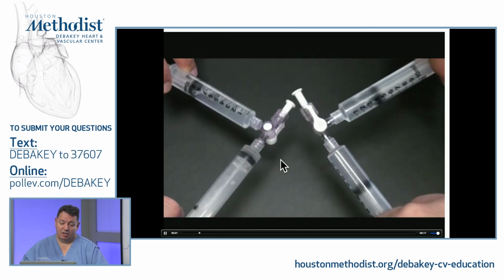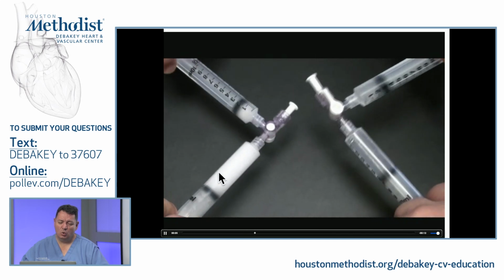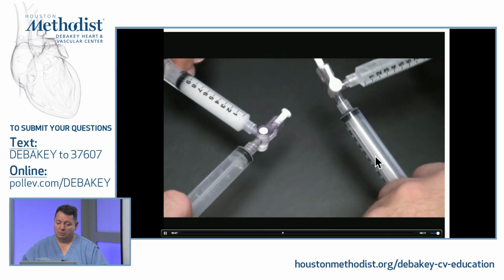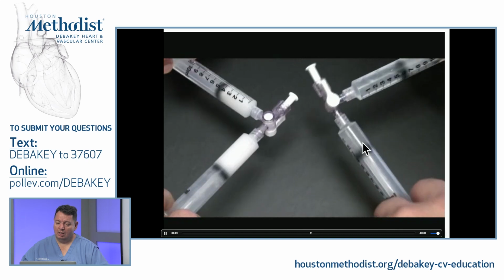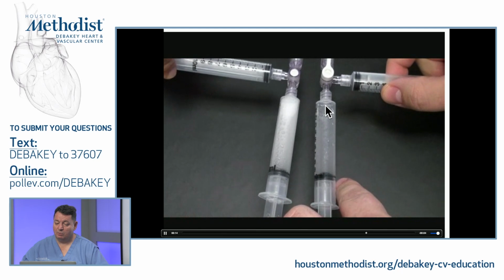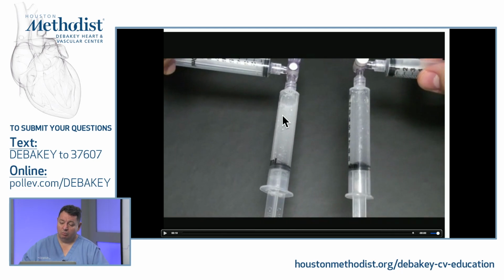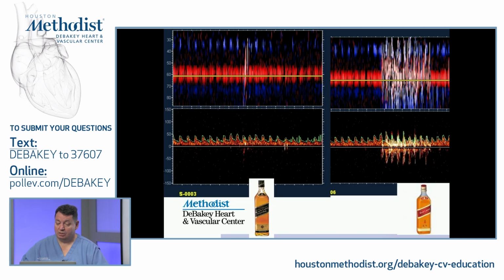Believe me. Here are the 2 different salines: white, gorgeous bubbles. This one, no bubbles at all. And when you stop agitating, it's absolutely dissolved in a second and you have 1 cc of air. This one takes a little bit. If you add a little bit of blood to that, that will be genius. So here's your black label, not much. Again, this is 2 minutes apart, same patient. With a red label, not to use on newborn, you have almost like a shower.